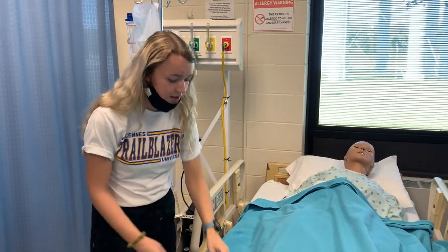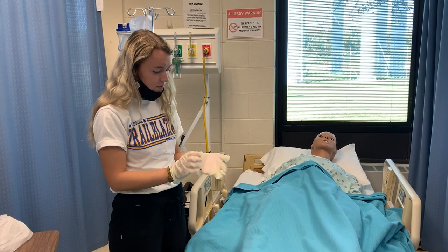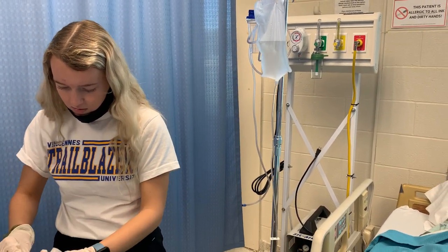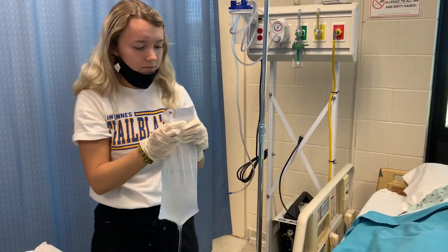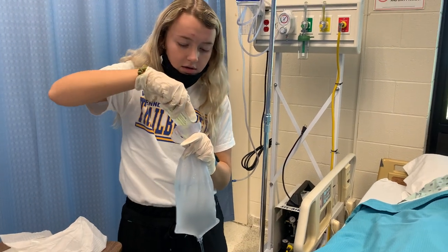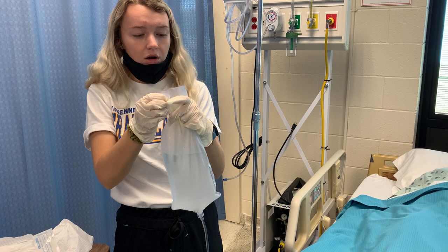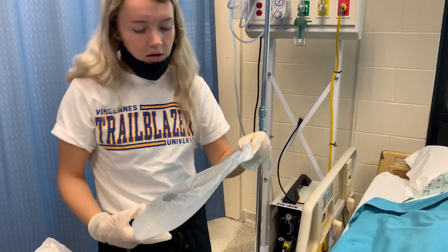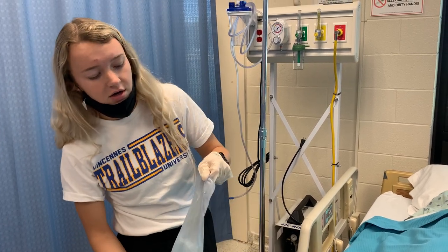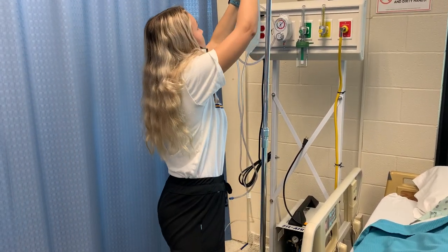We're going to raise the bed up to a working height. I'm going to put my gloves on. We're going to put the soap in. Okay, so I put the soap in, and I'm going to close it. I'm going to tilt it just to get it all mixed up. Make sure the water temperature is 105 to 110 degrees Fahrenheit. Once that is all mixed up, put that back up there.